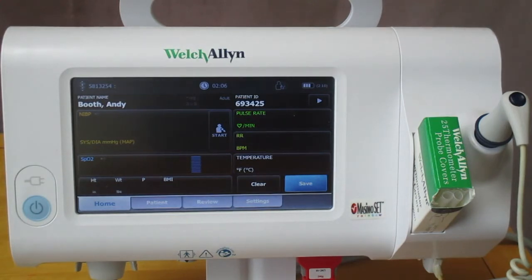First, you begin by starting your patient's blood pressure. While that is being taken, you can place the SpO2 sensor on your patient's finger. You can use any MASMO RDSet or LNCS sensors.